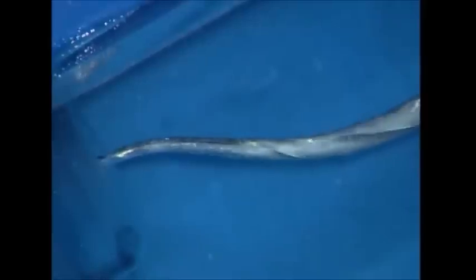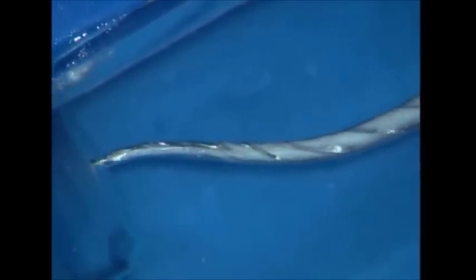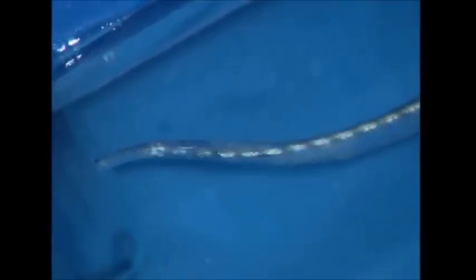Notice how the debris loads up on the instrument during the cutting action, whether we use a reciprocating handle motion or a balance force technique. Irrigate, recapitulate, and re-irrigate to move debris out of the tooth.